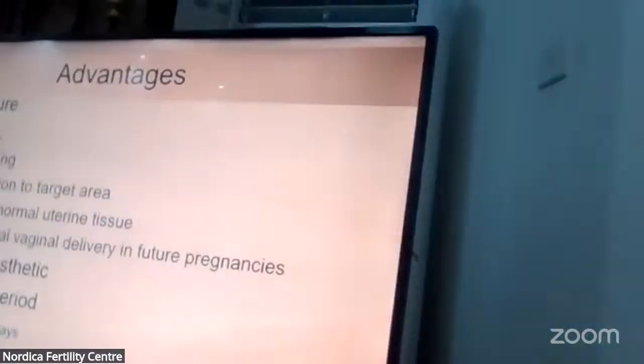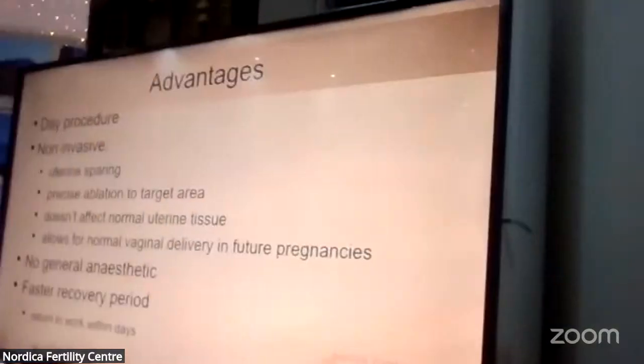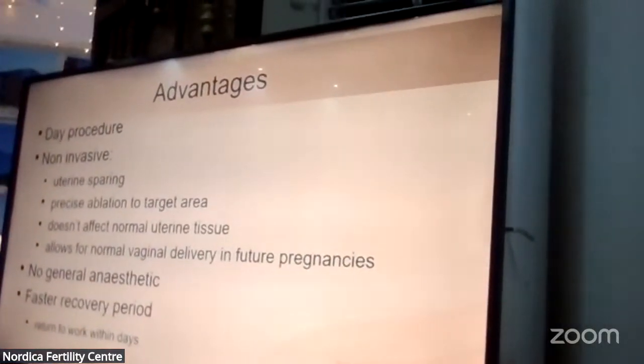All right. So what are the advantages of using HIFU to treat fibroid? Like we said, it is a non-invasive treatment option, meaning that we are not cutting the patient open. So the patient has the advantage of going home on that same day. After you've rested, the patient is at home. Because it's also one of the uterine sparing procedures, meaning that after treatment, the uterus is still intact. The patient can still achieve conception after HIFU treatment.